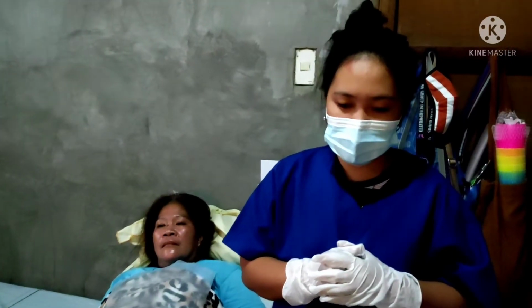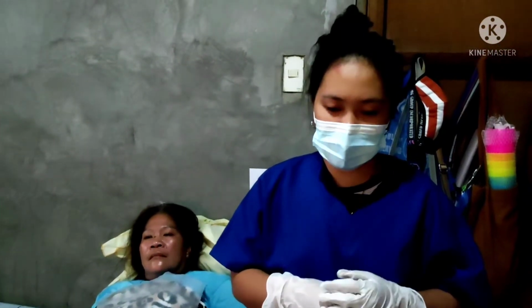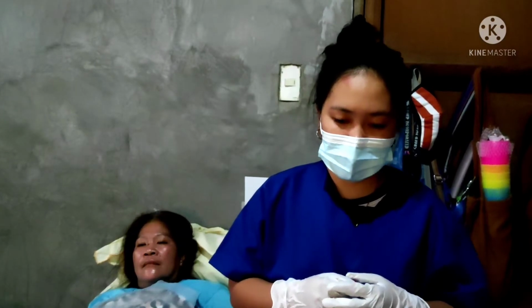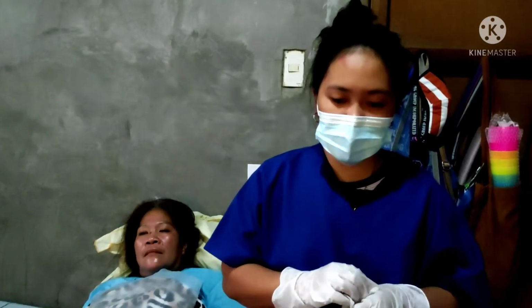Apply intermittent or continuous suction by placing your non-dominant thumb over the vent of the catheter for 15 seconds or less. At the same time, slowly withdraw the catheter as you roll it back and forth between your dominant thumb and forefinger.